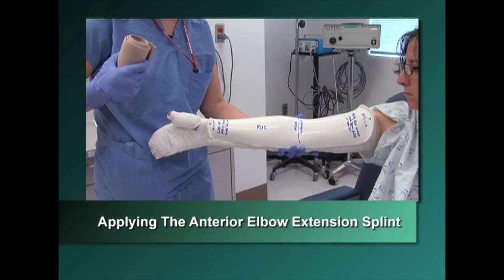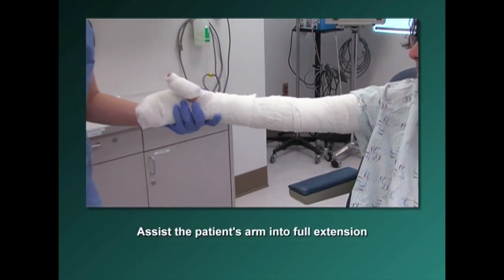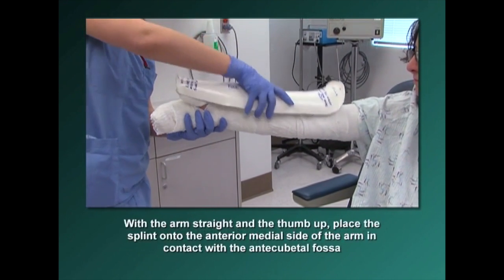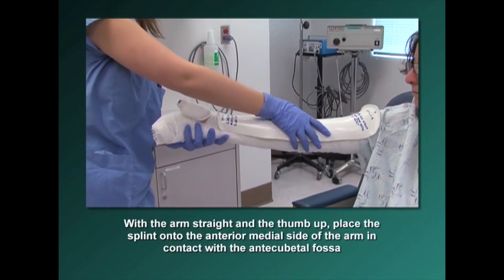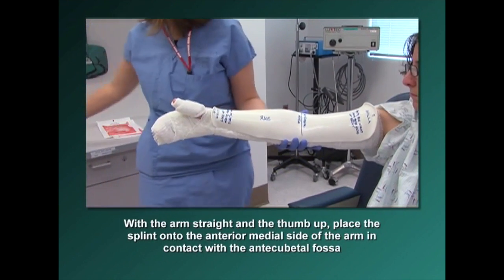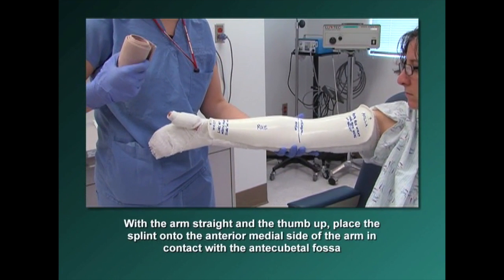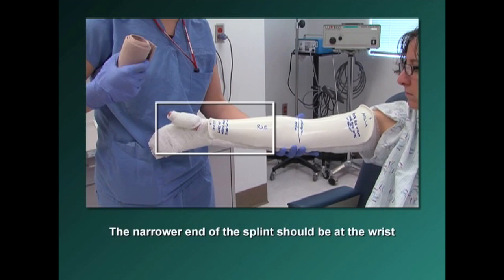To apply the anterior elbow extension splint, assist the patient's arm into full extension. With the arm straight and the thumb up, place the splint onto the anterior medial side of the arm in contact with the antecubital fossa. The narrower end of the splint should be at the wrist.